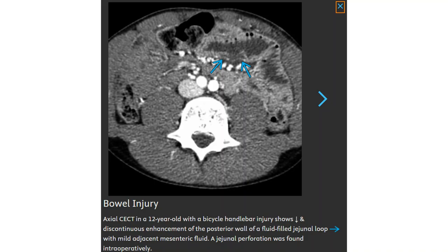Contrast-enhanced CT in a 12-year-old with a bicycle handlebar injury showing discontinuous enhancement of the posterior wall of the duodenum with mild adjacent mesenteric fluid. A duodenal perforation was found intraoperatively.